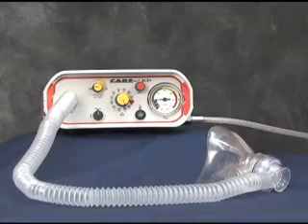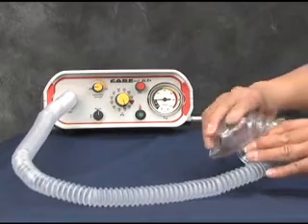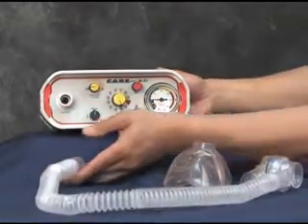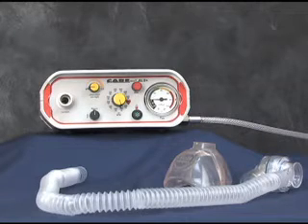The CareVent ALS Plus or ALS Plus CPAP control module style ventilators have just 2 pieces that require disassembly from the ventilator for cleaning: the universal face mask, and the single-use deluxe transport ventilation circuit. Their design makes the parts virtually impossible to misassemble. The control module can be wiped clean with a mild soap solution and a clean cloth.